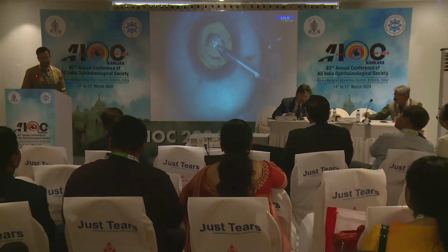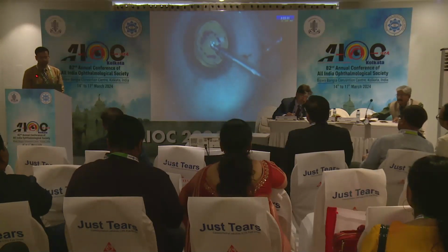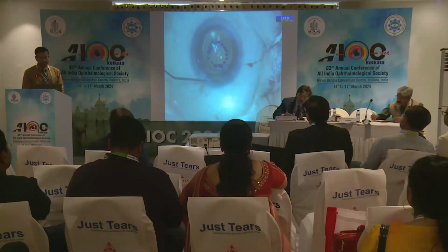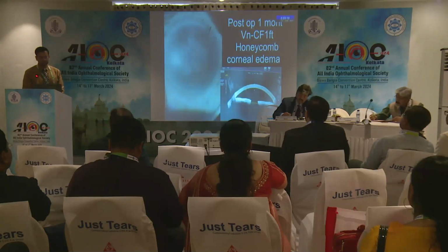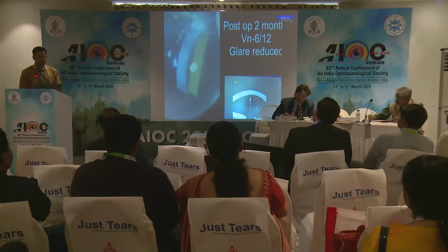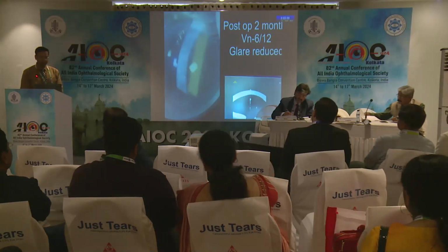So I'll be starting the patient on the routine post-op cataract regimen along with Rhopressa (netarsudil) 4 times per day. That is going to go for around 2 months. Sealing the side port incisions now, and sealing the main incision and finishing up the case. So 1 month post-operatively, the vision was counting fingers at 1 foot with the presence of honeycomb corneal edema. Around 2 months, the vision improved to 6/12, and the glare reduced.